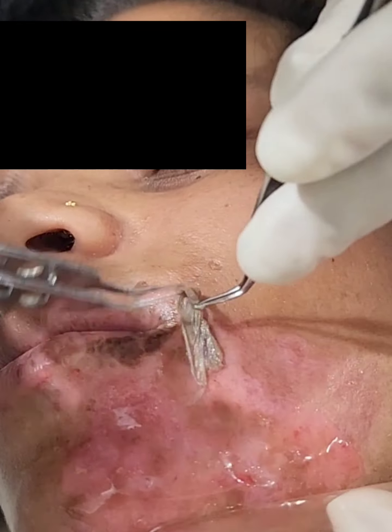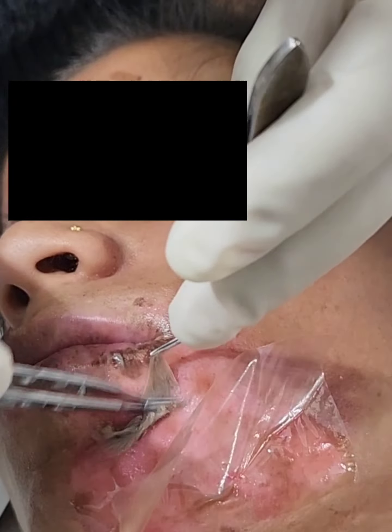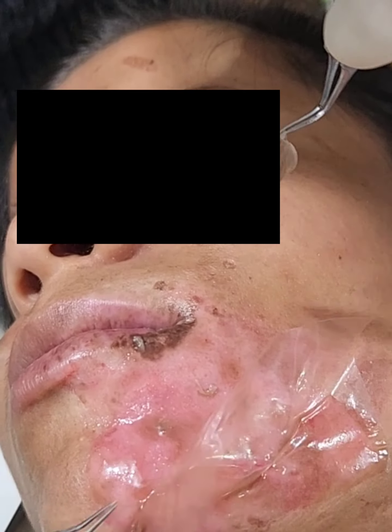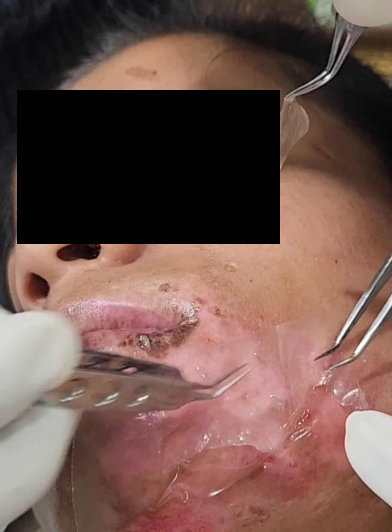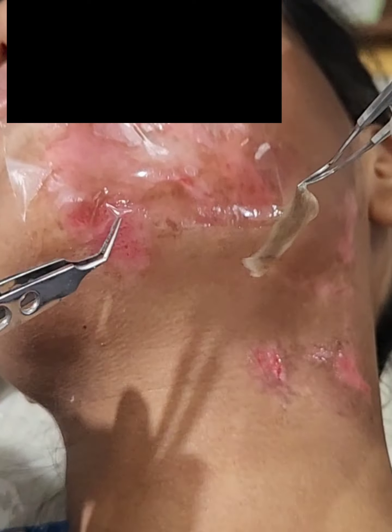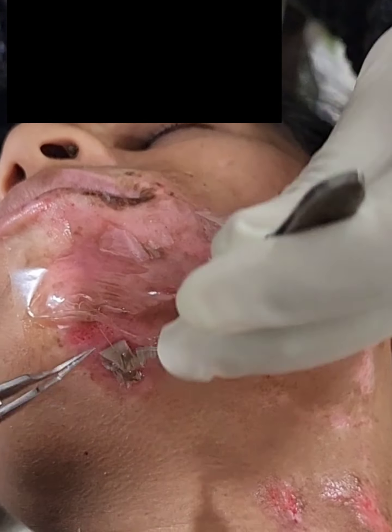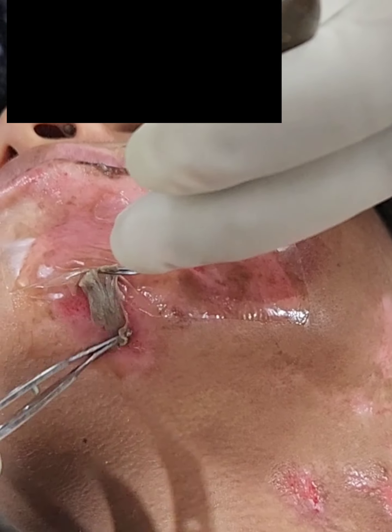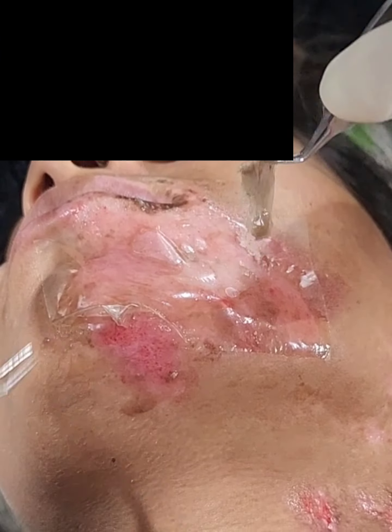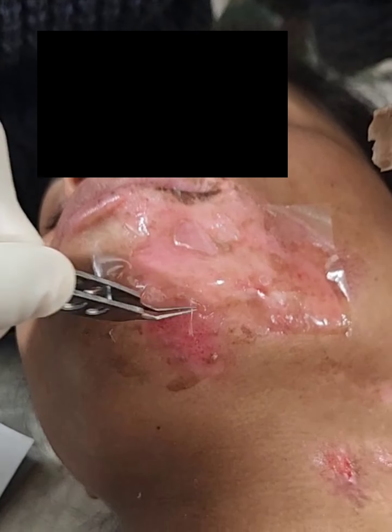You see the suspension is dark brownish in color. A lot of cells are getting separated out and these are thereafter closed. The brownish suspension is then closed with the help of a collagen sheet. The uncovered area is also covered once the cells have been transplanted. This area is closed with a collagen sheet and the residual epidermal fragment is then discarded.